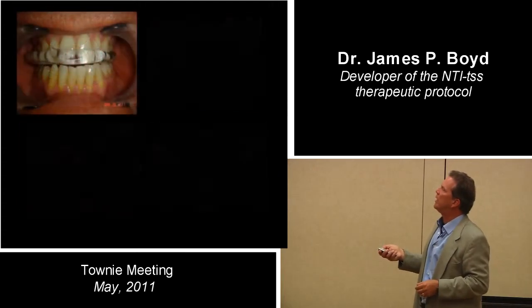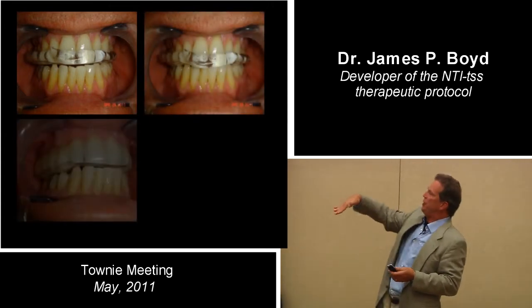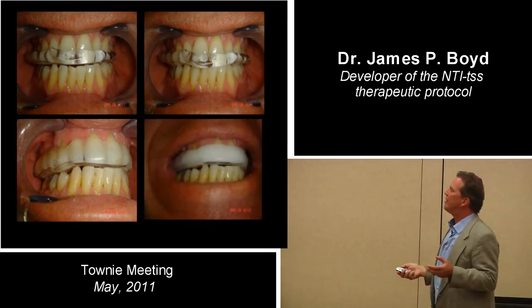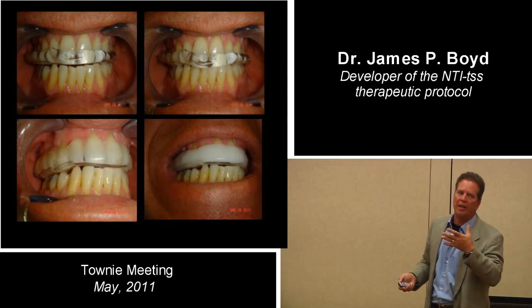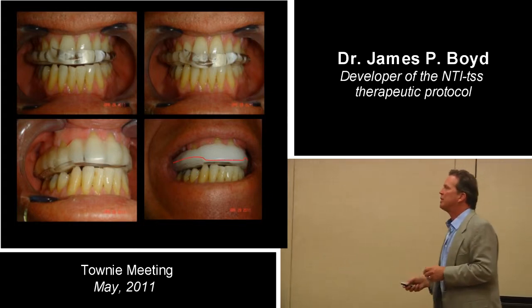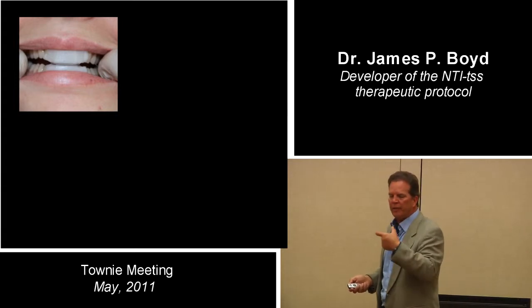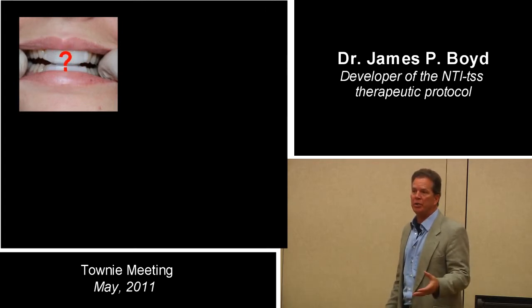Here's an upper flat plane with too much thermoplastic, and then squeezing into it, and the tray will contort and shape to the arch. If you've got tall bicuspids and tall whatever it is, it sort of forms to it, which is nice and everything, but the patient has to squeeze on it for a long time for this arch to hold its shape, for the stuff to finally cool. And it became kind of proud of that, and it's still way too much thermoplastic. So my thought was, if dueling sliders is so slick and so slippery and so easy to do, why not dueling flat planes? Because we'll see pictures of a flat plane, clear, hard acrylic splint with nasty gouges in it. It's amazing what people do to those things.